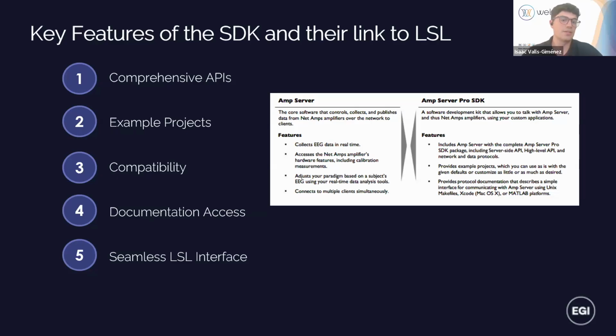While you're welcome to go that route and work directly with the SDK, it does require a fair amount of familiarity with these tools, and we currently provide limited support on the SDK side. That's exactly where LSL comes in. LSL is built specifically for the synchronization of real-time data streaming, like I said.